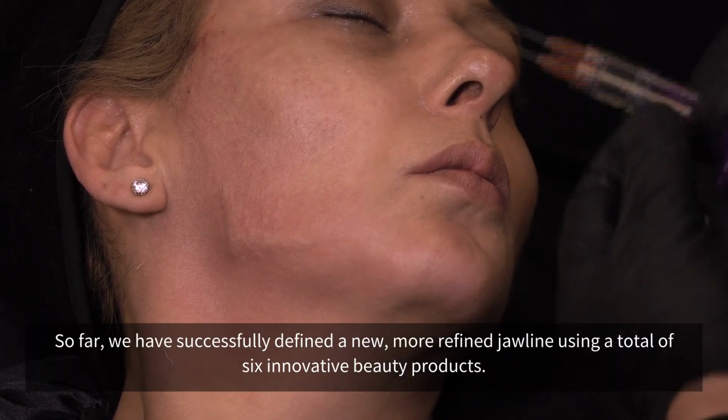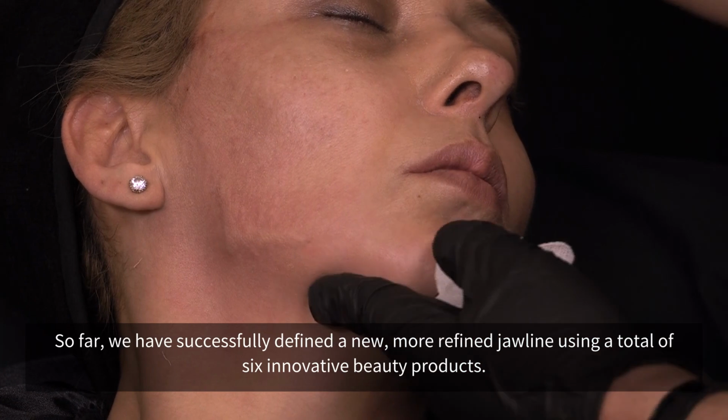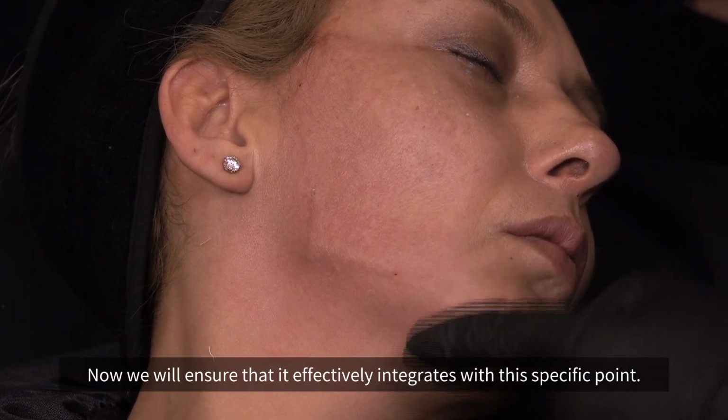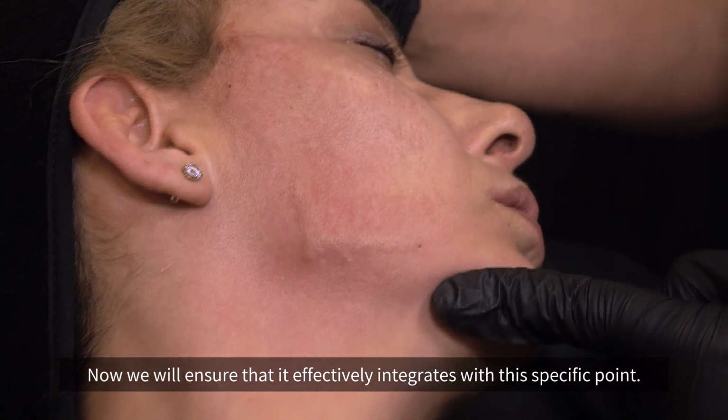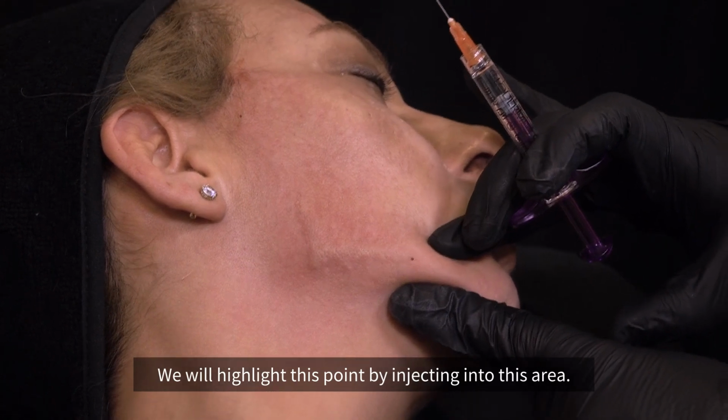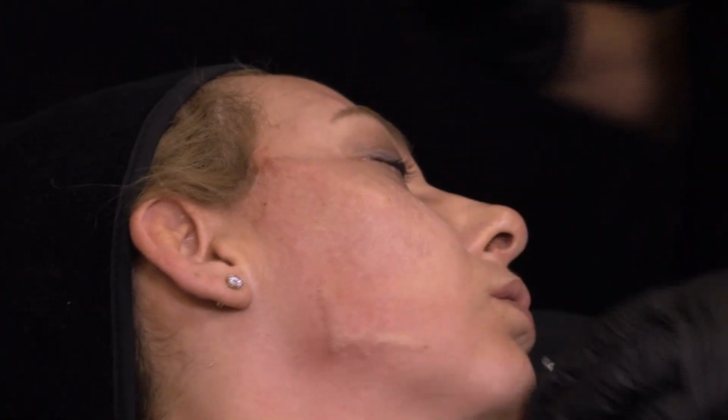So far, we have successfully defined a new, more refined jawline using a total of 6 innovative beauty products. Now we will ensure that it effectively integrates with this specific point. We will highlight this point by injecting into this area. I'm going back to the front of the face.